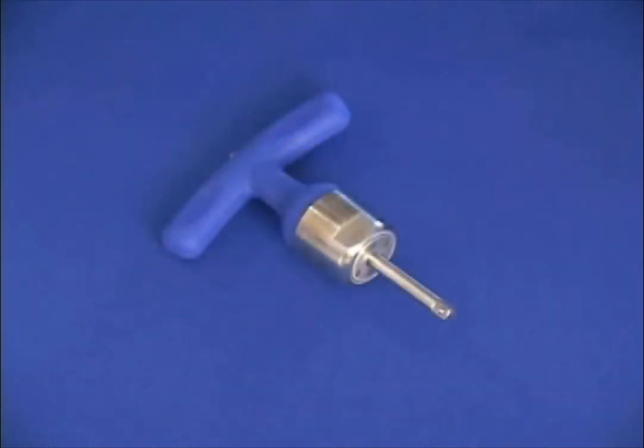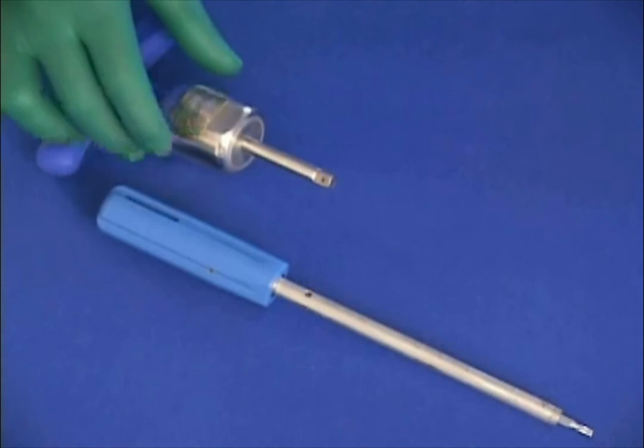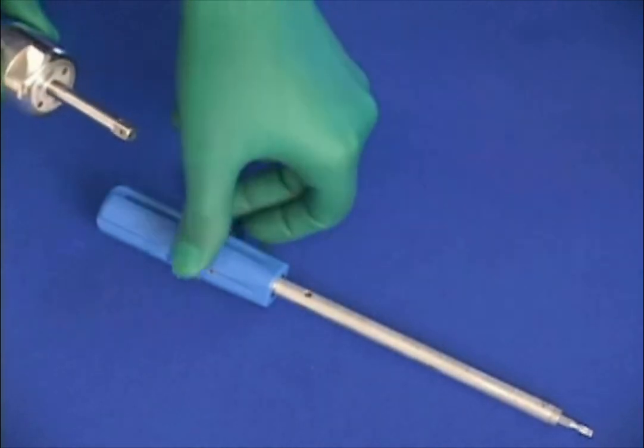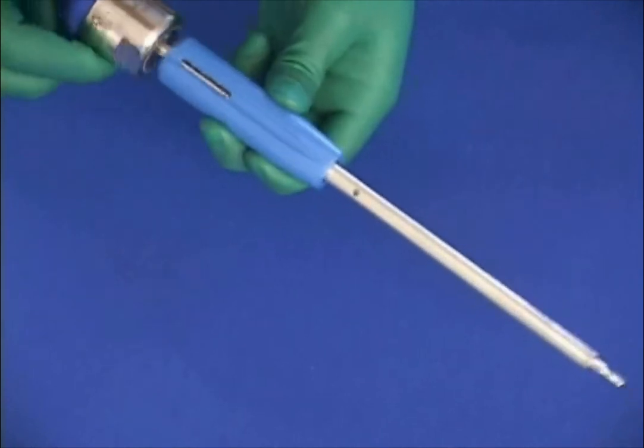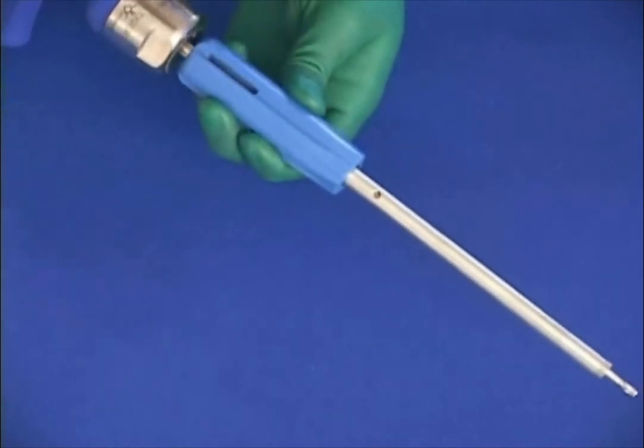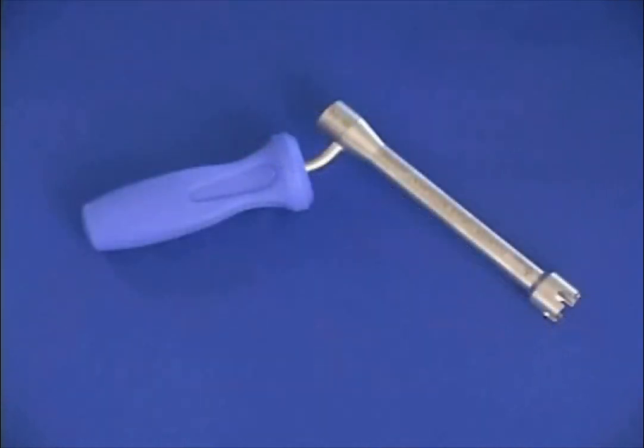The torque limiter ensures that the correct final locking torque of 65 inch-pounds is achieved during final locking. Prior to final locking, the extended hex end of the torque limiter is inserted into the recessed end of the torque screwdriver to assemble the two instruments into a single unit. The counter-torque instrument is utilized to stabilize the construct during final locking.